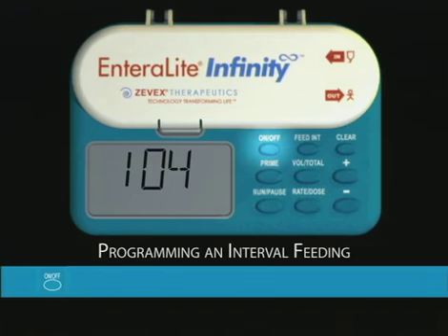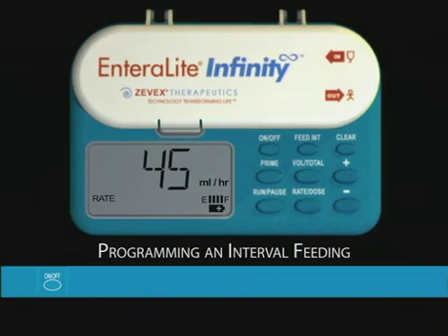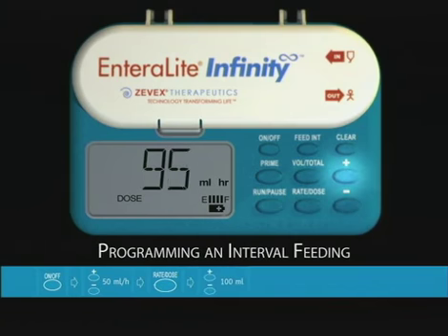Press and hold the on-off key to turn the Infinity on. After it runs the self-test, the display will show the last programmed rate. Press the plus or minus key to change the rate to 50 milliliters per hour. Press the rate dose key to display the dose. Press the plus or minus key until the dose of 100 milliliters is displayed.